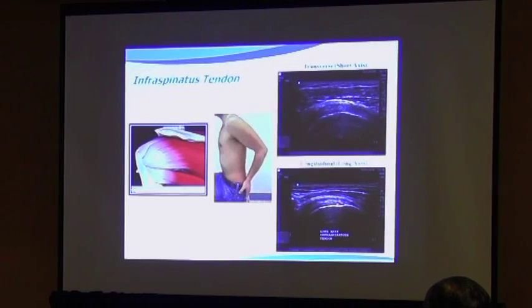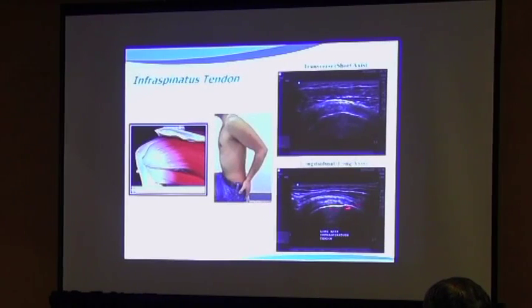The footprint, if you're looking in long axis at the infraspinatus tendon versus a supraspinatus tendon, you'll notice that the angle of this flattened area of where the infraspinatus fibers attach is shallower. It's a steeper angle of that anterior one. So if you're looking in long axis, you're wondering which one's which, you can almost feel yourself going from that anterior flattened portion to the posterior flattened portion, and you'll feel your transducer often rub right over the protuberance of bone separating the two.